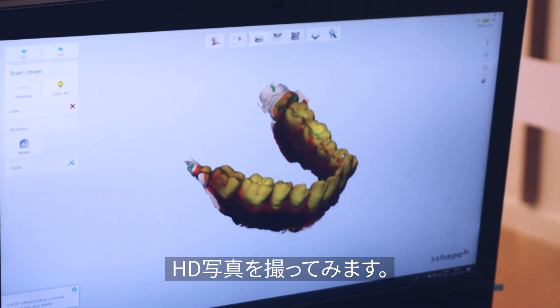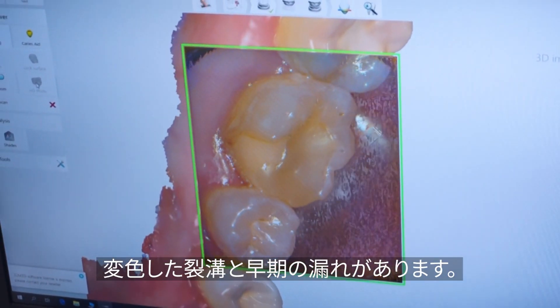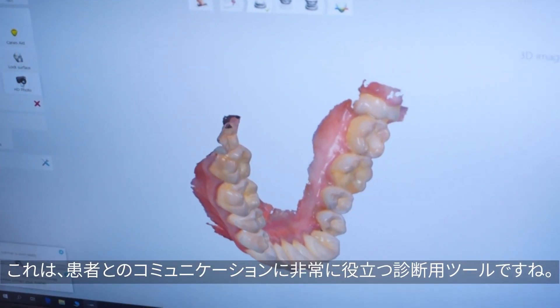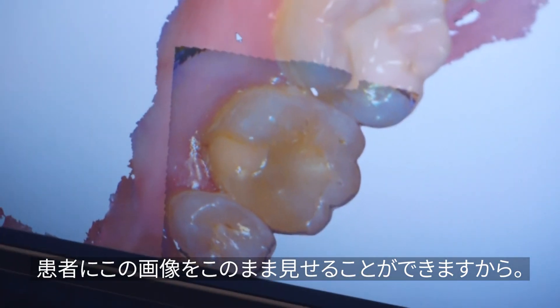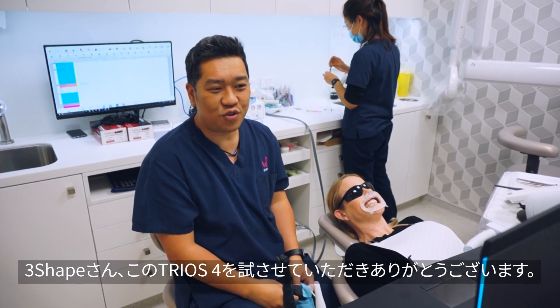We're going to try and take an HD photo of that area where there may be some problems. You can see a large composite restoration with a stained fissure showing signs of early leakage. This is a really good diagnostic aid — you can show patients this directly. It seems like a really good tool.